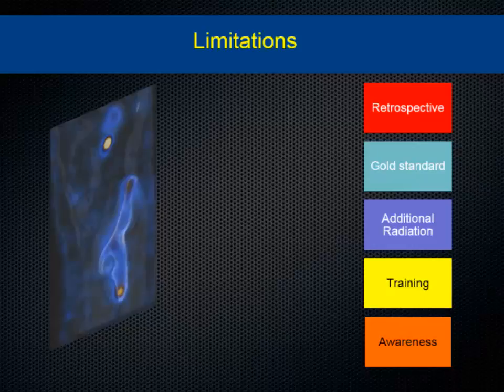But if you justify you're going to give a definitive diagnosis, then it's better to do it at a one-stop imaging rather than doing multiple investigations and delaying the diagnosis rather than giving a definitive diagnosis.